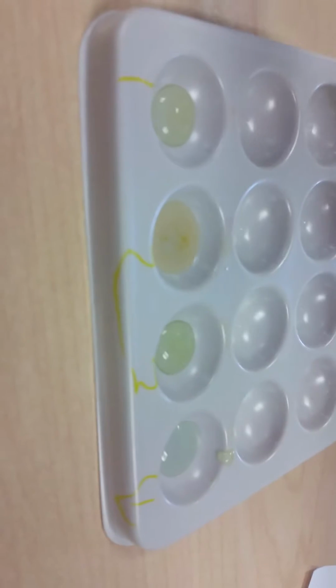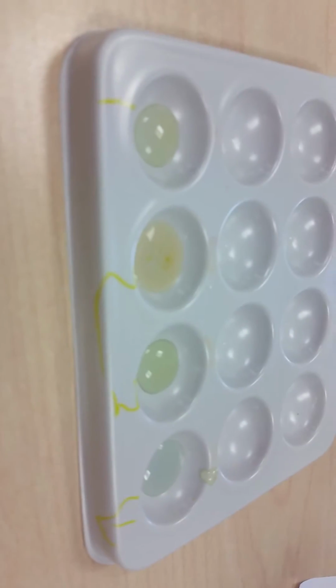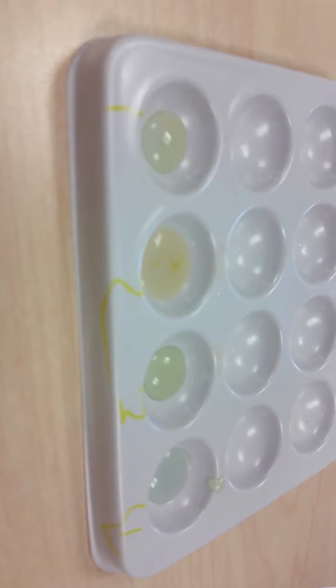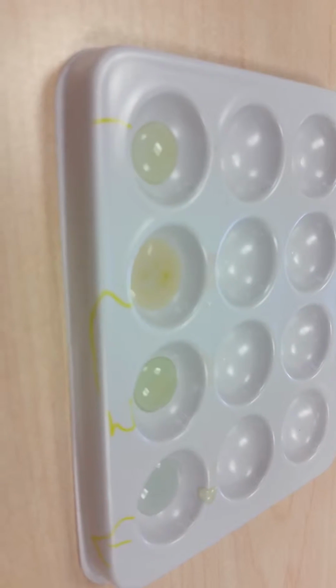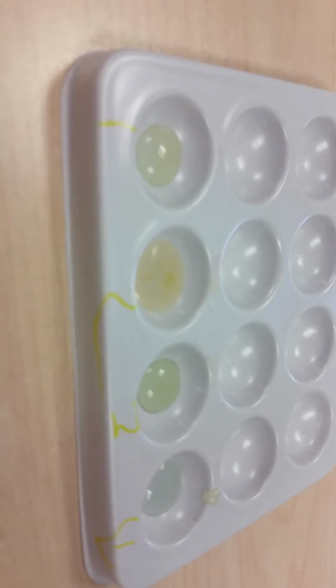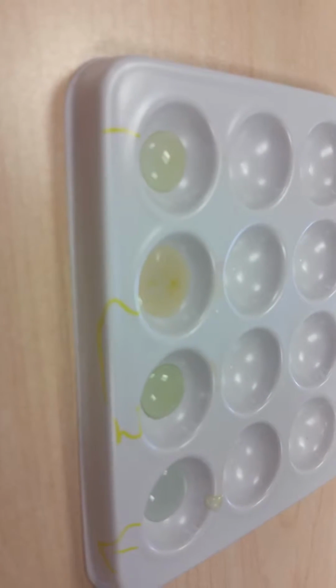So if you take a look at your samples, the reddish color is showing up in patient number 2. So it appears that patient number 2 has protein in their urine.